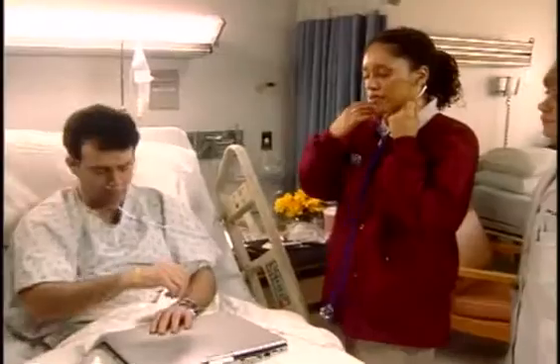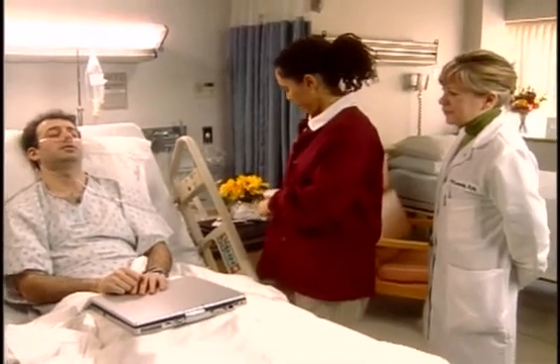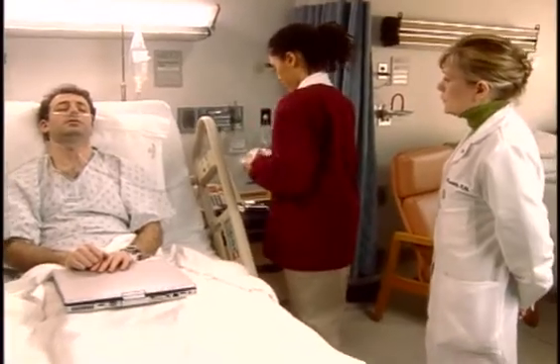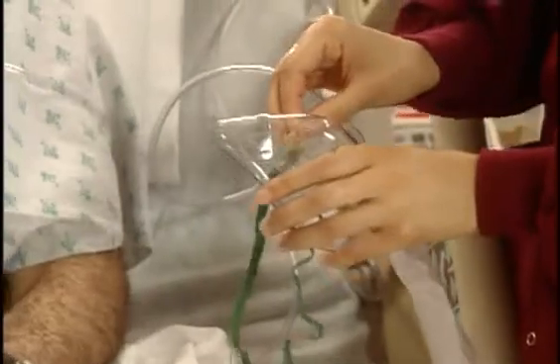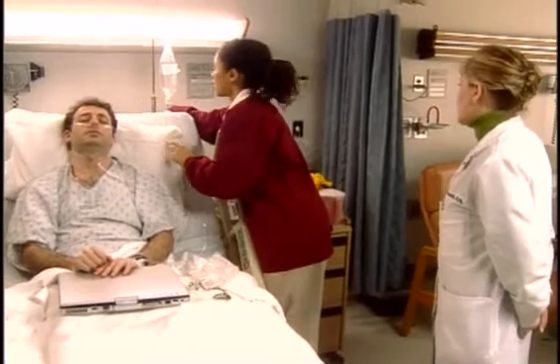Okay, Mr. Simon. We're gonna get the face mask connected to the setup, okay? Okay, remove both flaps from the mask. All right, I'm just gonna lay this right next to you.